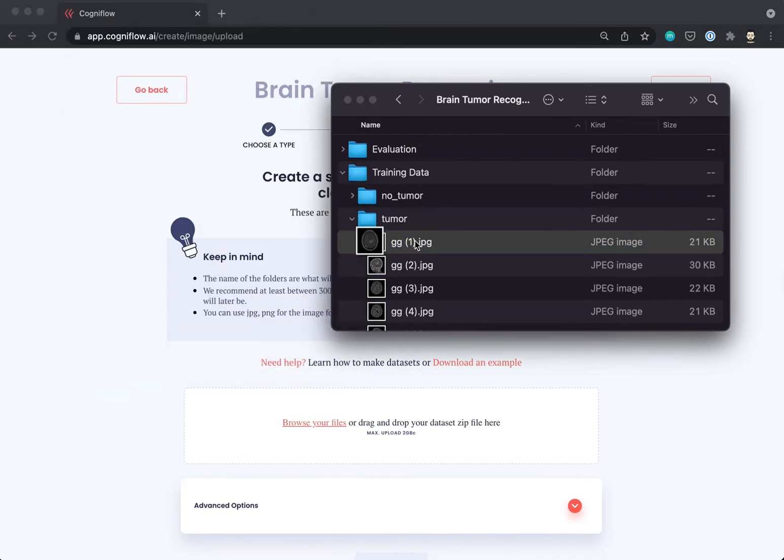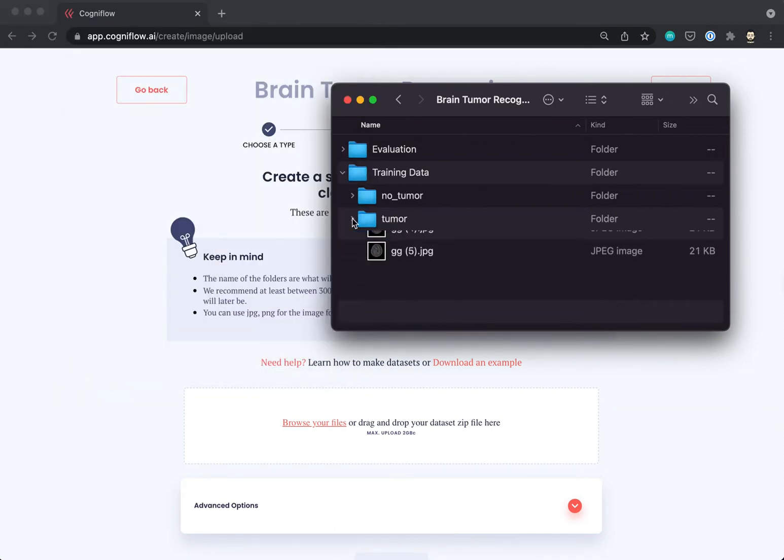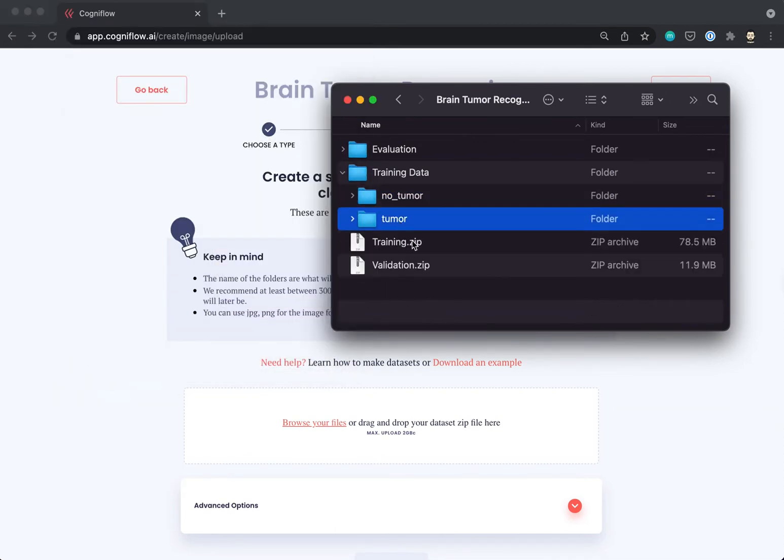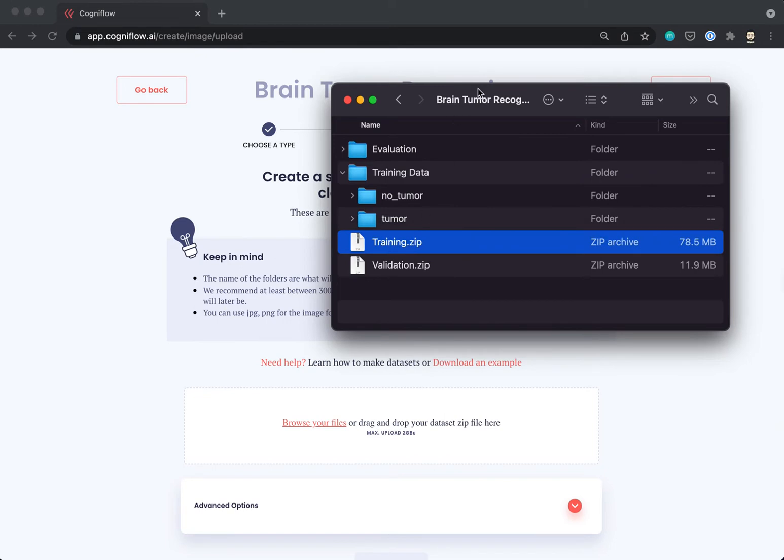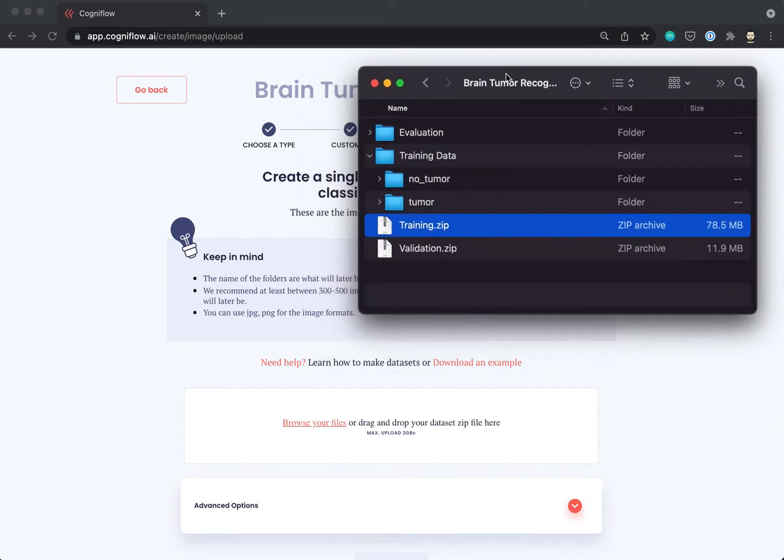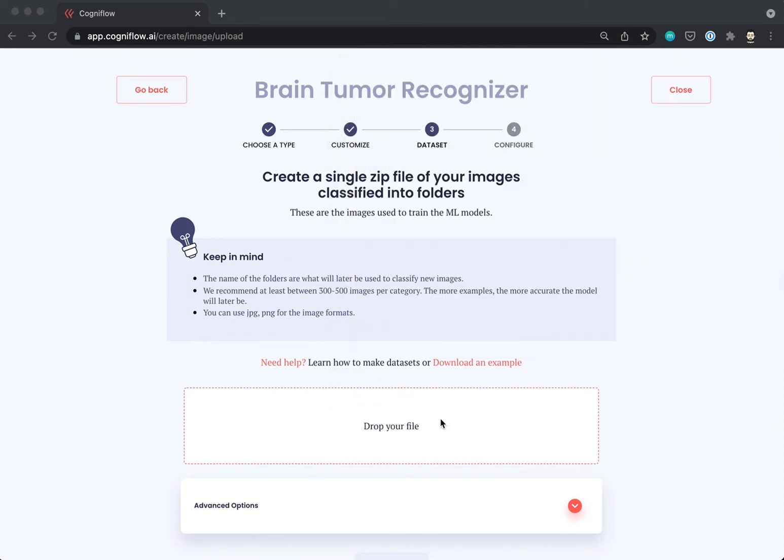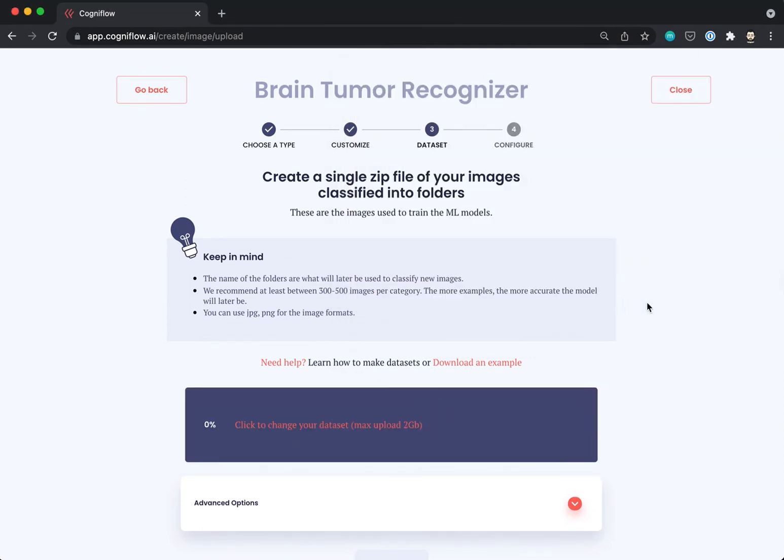In this example we have two folders, Tumor and No Tumor. Each folder contains several images that represent the proper assessment. Then, we drag and drop a zip file containing the two folders, and we press next step.